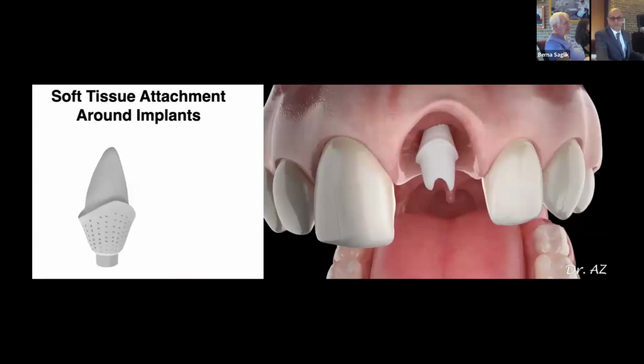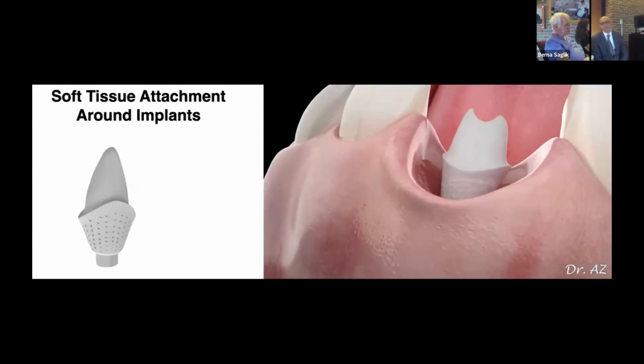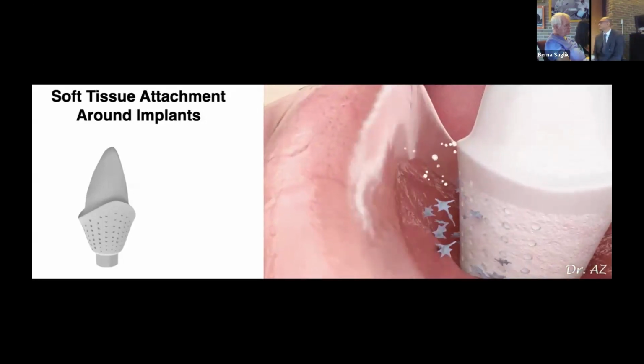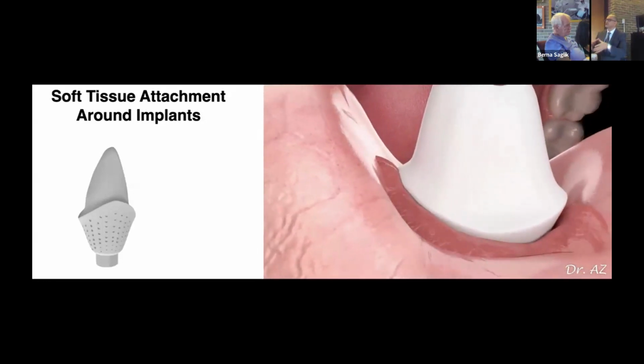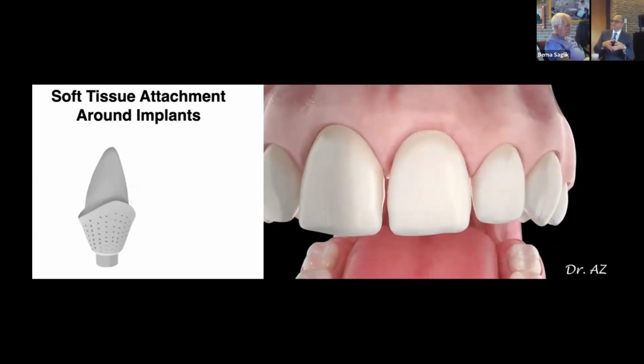And this is the concept that we're working on, and I put it in animation. The abutment goes in with a polished and a rough surface. The rough surface attracts your fibroblasts for a good connective tissue attachment, and epithelial will attach to the smooth and polished surface. This way you get a good attachment around implants. Hopefully that decreases peri-implantitis and also gives you a firmer connection, maybe supporting your epithelial attachment with a better height of the gingival margin, right?